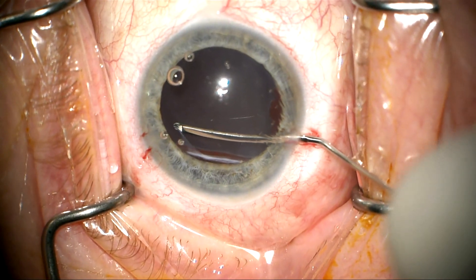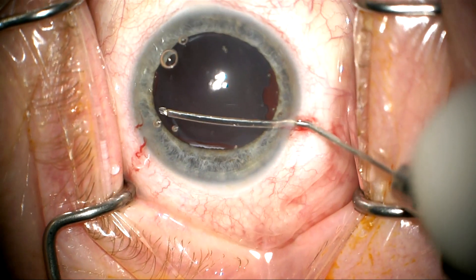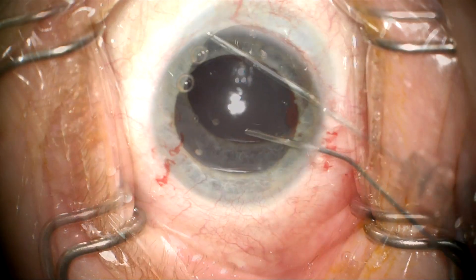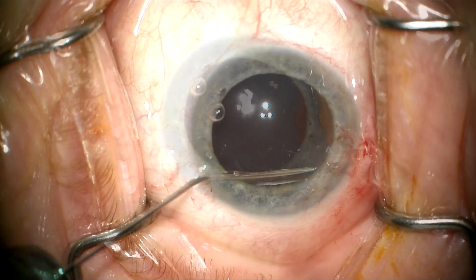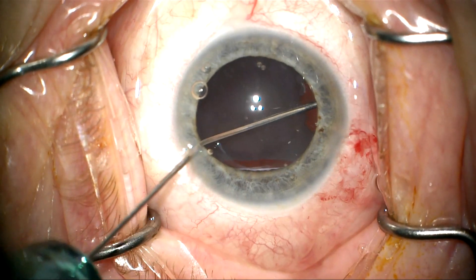It's very difficult to see any details because there's no red reflex, but we're trying to find the capsular edge. On this side it's a little bit more fibrotic, so it's a bit easier to see it. We can get under there with a dispersive viscoelastic and then switch to cohesive viscoelastic and start inflating the capsular bag.